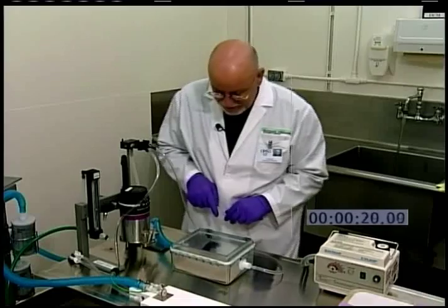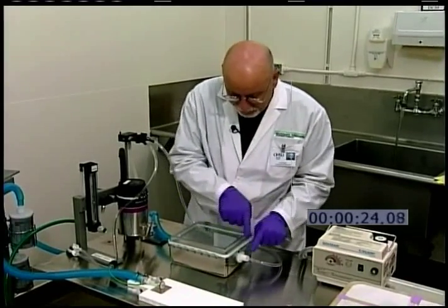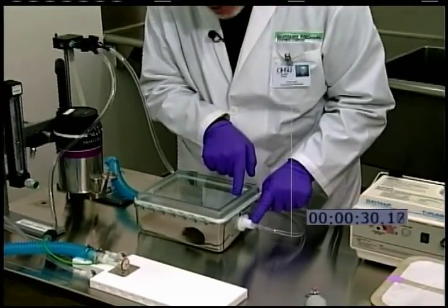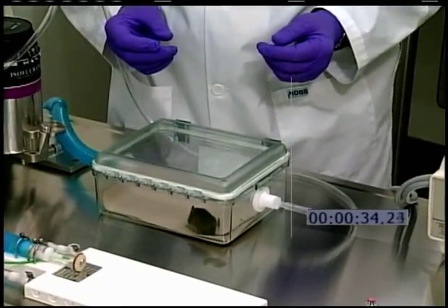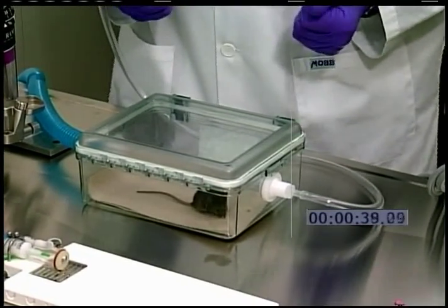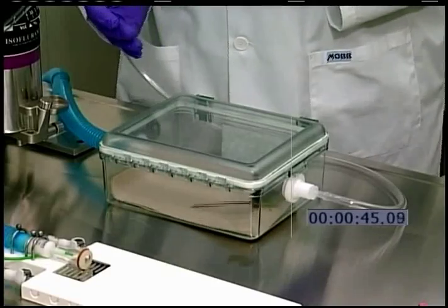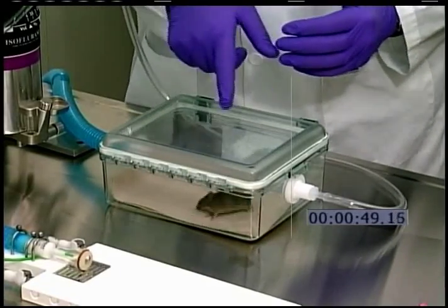What we often see, they get curious when they begin to smell the inhalant anesthetic coming in from this side. And as this guy is doing right now, he's just kind of hanging around here. Every once in a while he takes a sniff. In about 30 seconds to about 45 seconds, we should see him start to go through the excitation phase where he might defecate and urinate. And then in the period of about 45 seconds to a minute, he'll start to lose his righting reflex. He'll start to get wobbly.